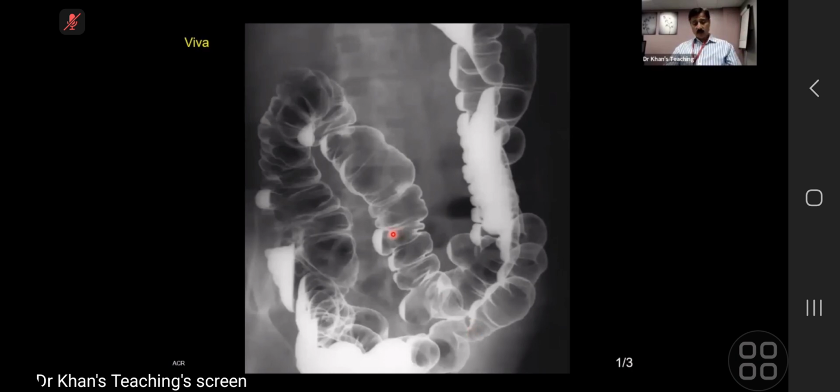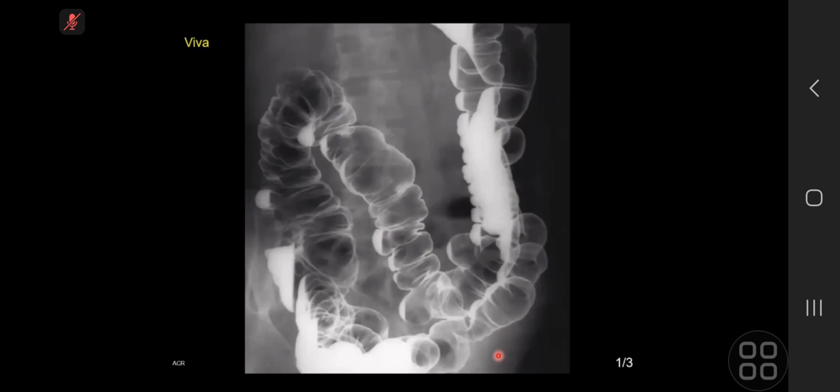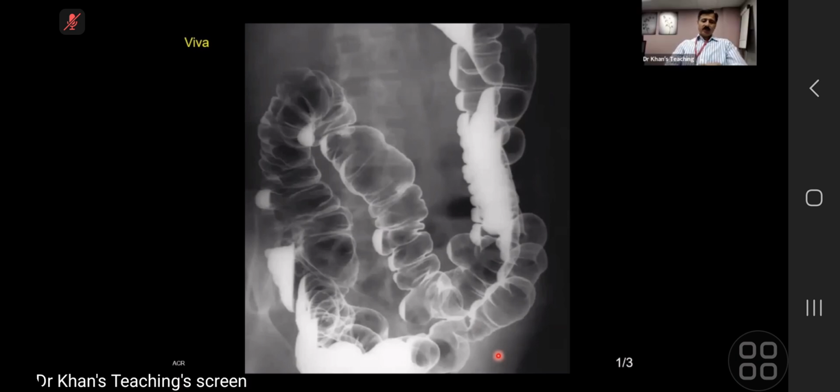you see, look at, they're quite wide necked. They're quite big. Okay, let me give you a hint. This patient is under the care of the rheumatologist. So whether these are inflammatory. Rheumatology, hint again.